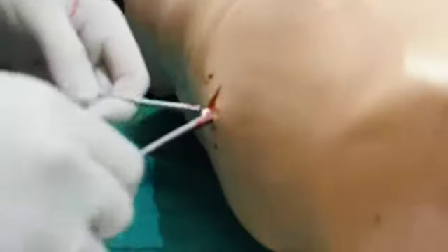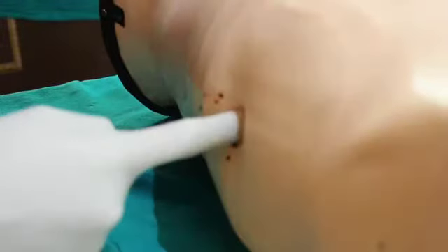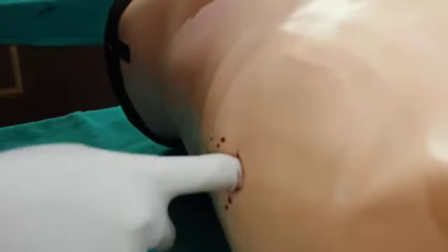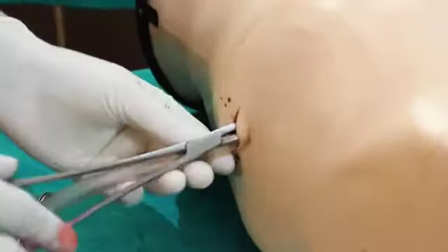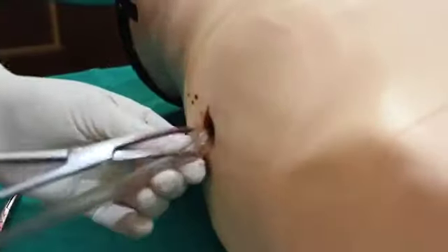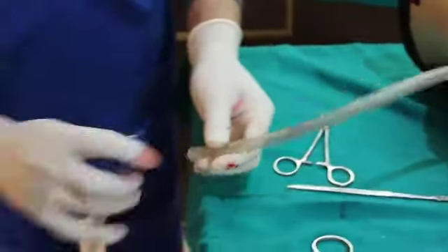Again, dissect and dilate. Now you insert your finger and you can feel the inflation and deflation of the lung, ensuring that you are in the right space. Now take a large hemostatic clamp, clamp the tube and insert inside. Remember, this is a scenario for pneumothorax. Now attach the tube with the underwater seal drainage and you can see the bubbling.